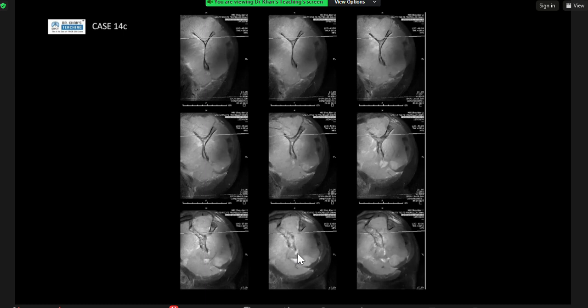Yeah. Excellent, good. And part of assessing any bone tumor, particularly Ewing's, what would you be doing as the next step? So you're reporting the X-ray. The X-ray you suggested doing an MRI. You've now done the MRI. What are you suggesting in your MRI report?